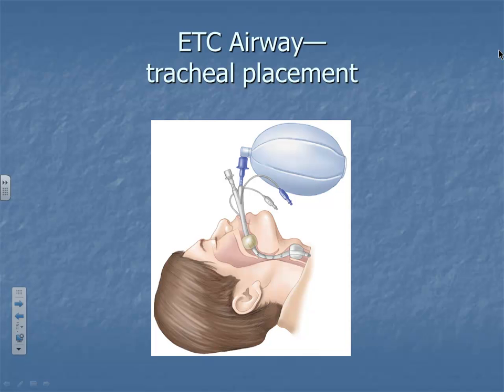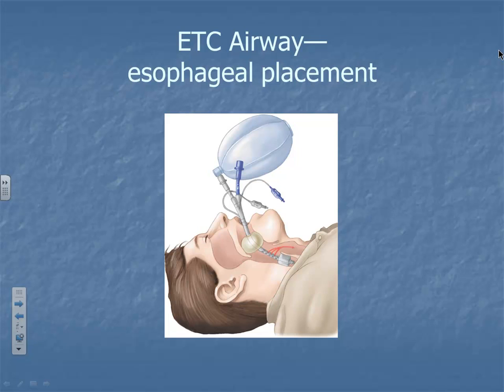And then you've got to be smart, too. You've got to know which one of these things should be, you know, to ventilate through. If you ventilate through the wrong one, and you're in the trachea, you ventilate the wrong one, you're going to fill up the stomach. So it's important that you know the difference, and we'll revisit those in the lab also.